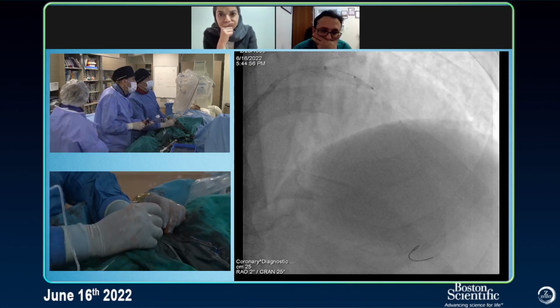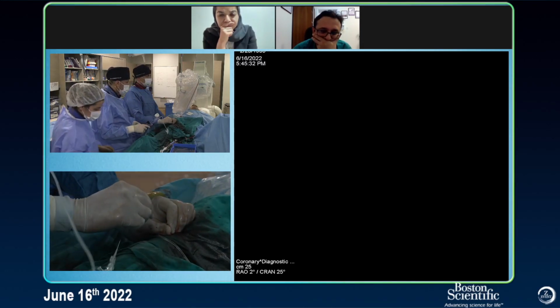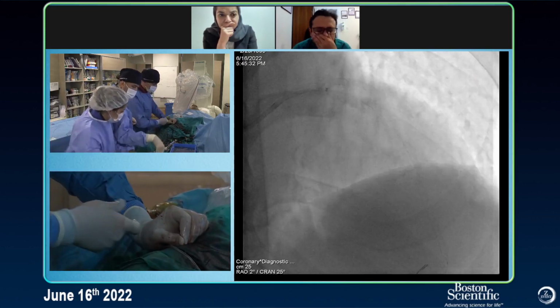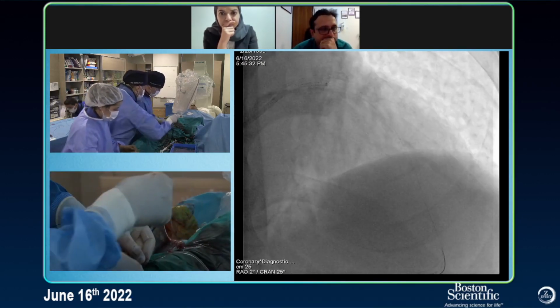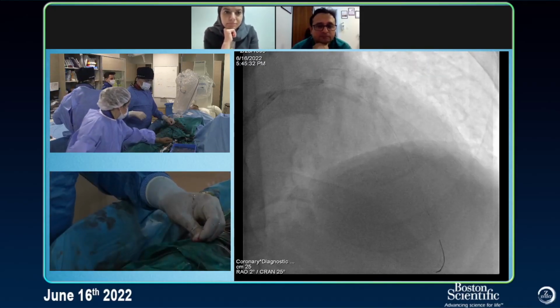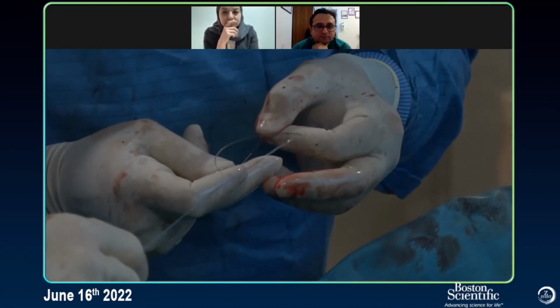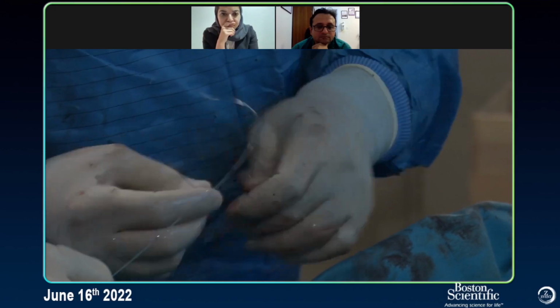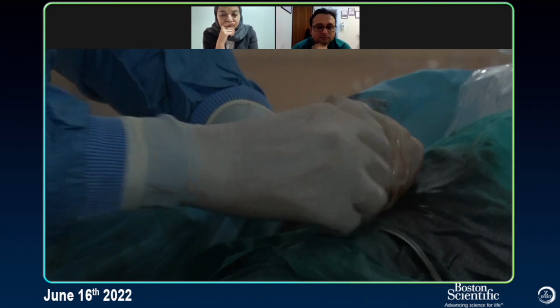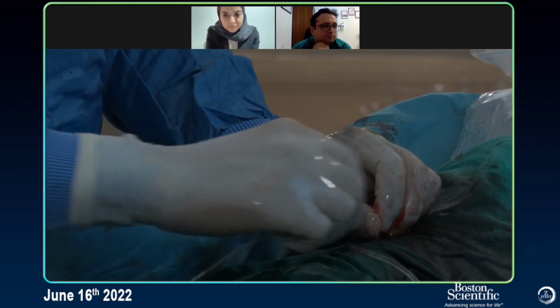16-18-20. Yeah. 3-0. 3.5. So first I like to have the trio 3.5-28 and then 3.5. I like to put the first stent below the diagonal, sorry, below the diagonal.